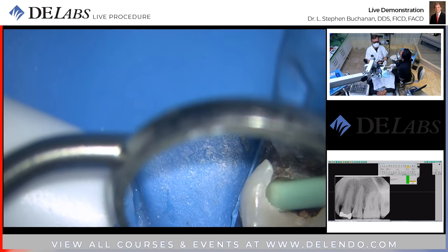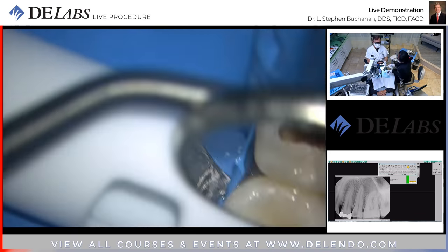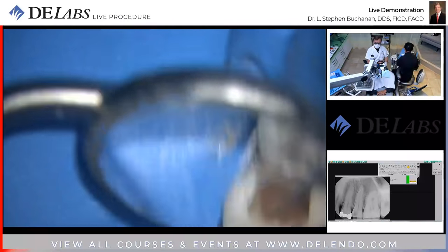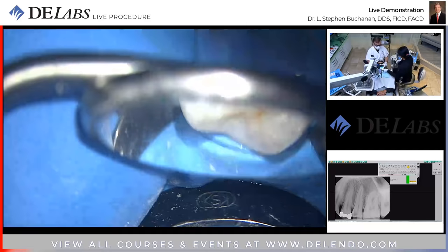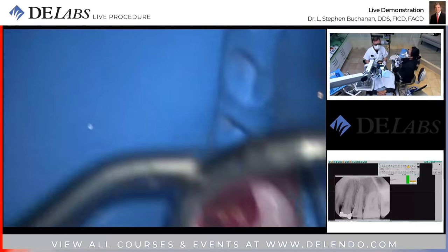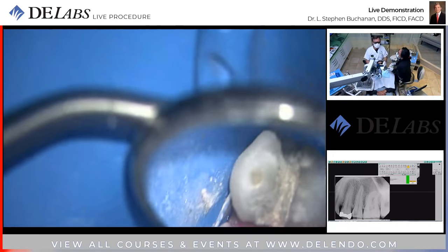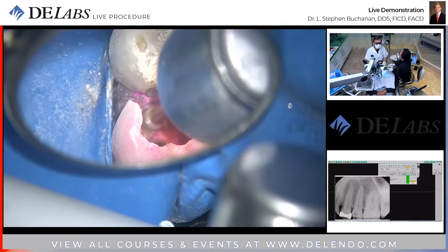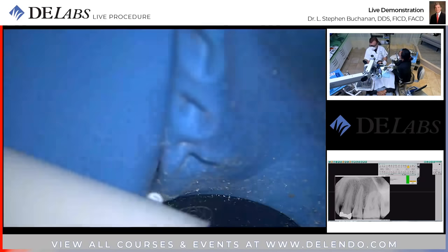Wash, please. Hard in spite of the stain. So we may be creating a hybrid layer there. Let's put a little bit of dye on it, see if that helps see the difference. Not too bad. Can we just shave it a little bit at the base? There we go. A little less stain there. Now, okay, that's good enough for me.